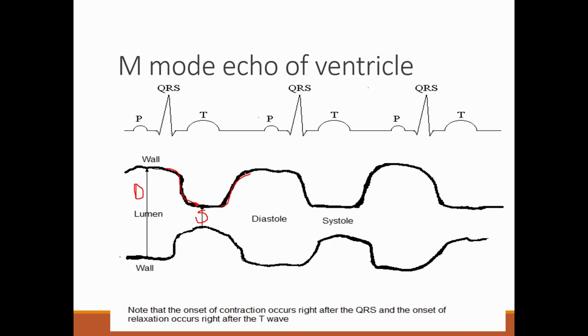So that was one big thing about the M-mode: you could calculate percent shortening, but you could also think about where we are in the cycle. If this is systole, then at this point we are in full ejection, right? Then we get the signal to relax, and as cells are relaxing, you would see the chamber coming apart at diastole.